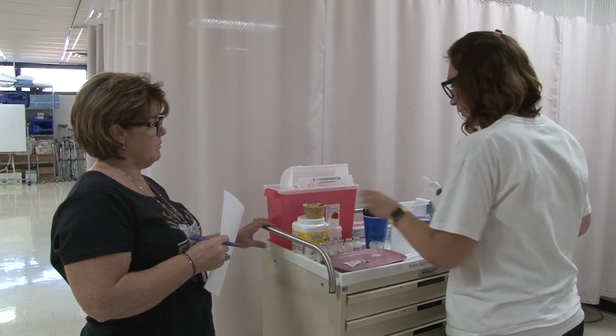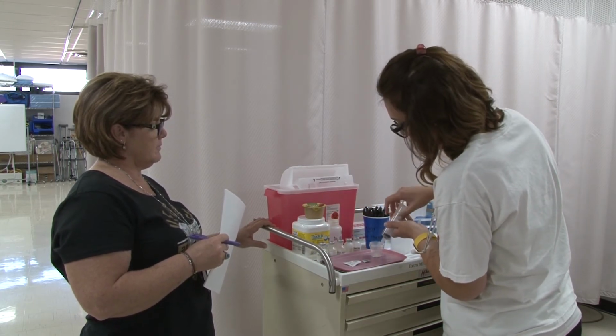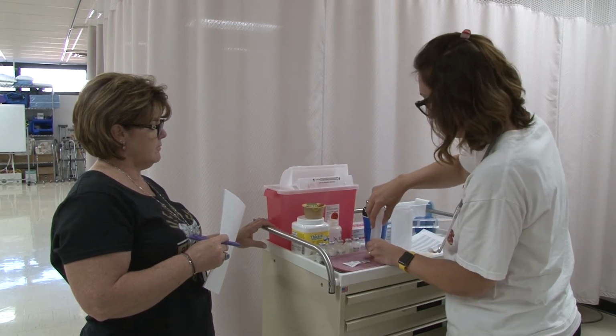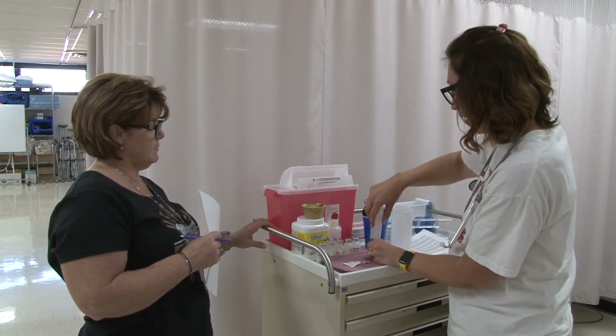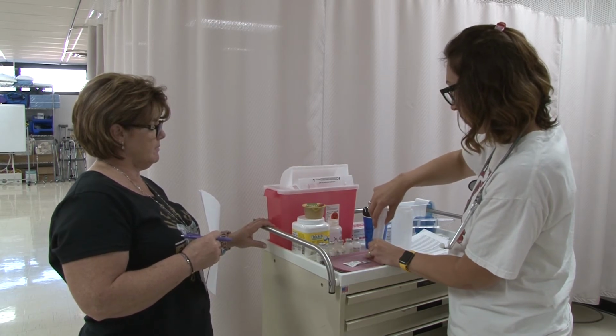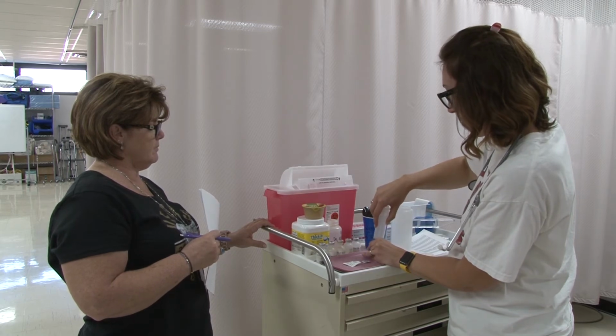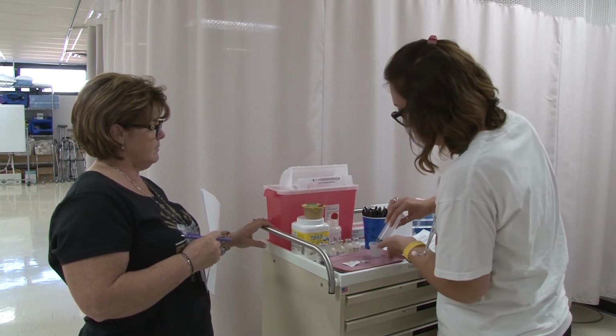And then mix it. Make sure it's diluted and liquefied really well. When I think I'm ready, I'm going to go ahead and draw it up into my syringe.